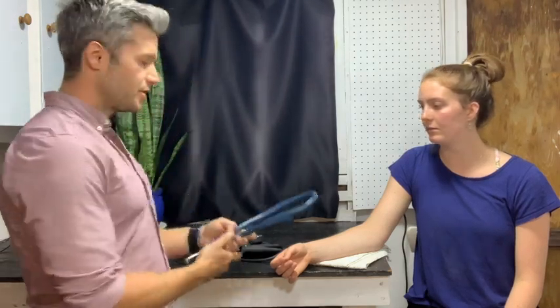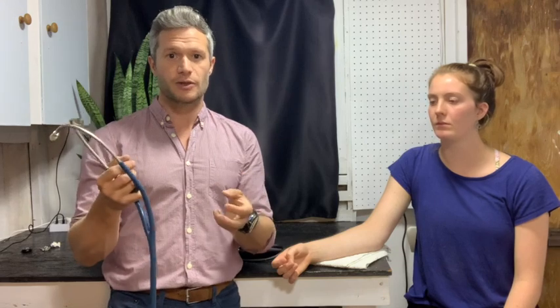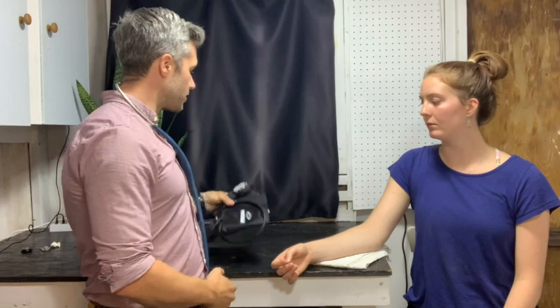Just a quick familiarization with things. This is your stethoscope. As I mentioned before in the lecture, you want to make sure that it's turned on and that the ear pieces go forward into your ears rather than pointing back. Typically to start off, you want to try to learn the logistics of how to keep your hands free and do a couple of different things at the same time. You might notice things like leaving the stethoscope here or placing them in my ears beforehand. When I'm using the blood pressure cuff, you might notice that I have only one hand on the bulb and the valve, so I can balance and manage all the different pieces of equipment. You should try to do the same.